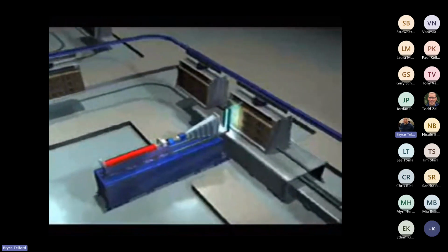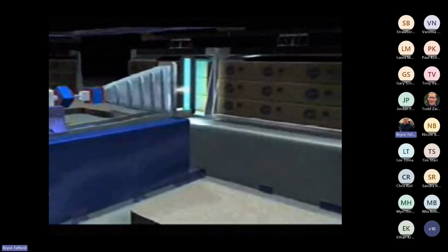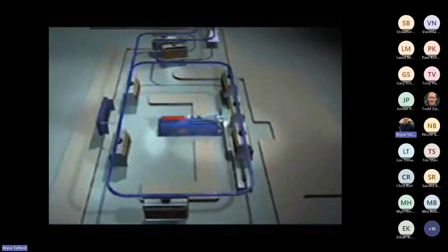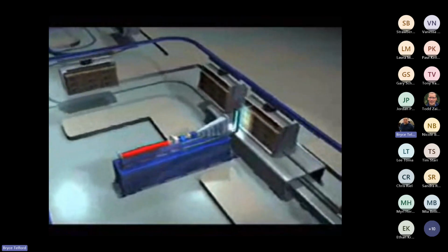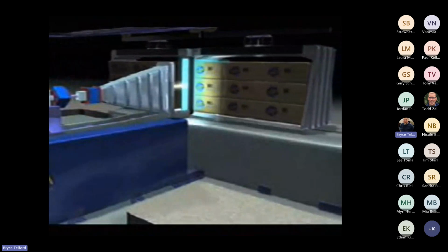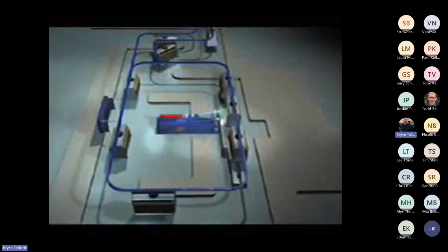The comparison that tends to work very well with radiation, just like on the previous slide, is that we could think of gamma as similar to having a heat source, and then we're absorbing that by placing it in proximity. So we have our rotisserie chicken. Well, with electron beam, when we're doing this flip, it's an awful lot like with our food, how we're flipping it over to help it cook evenly. So electron beam does tend to be a lot like how you're seeing here.